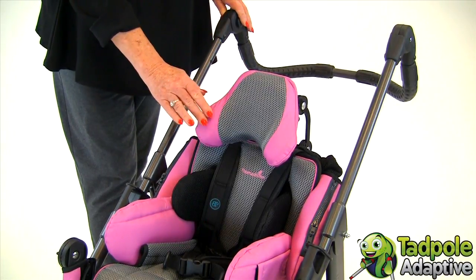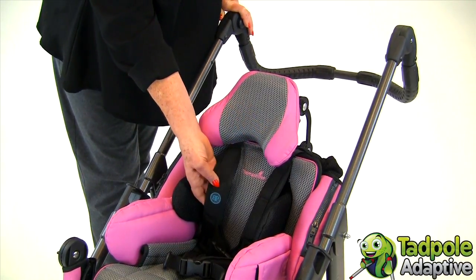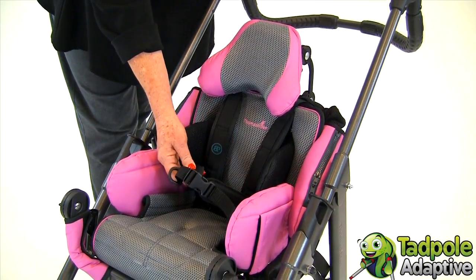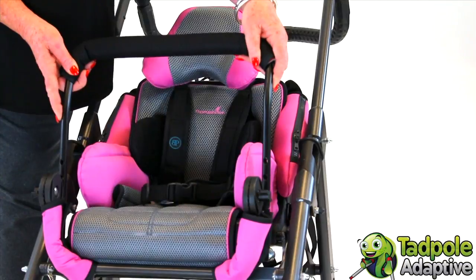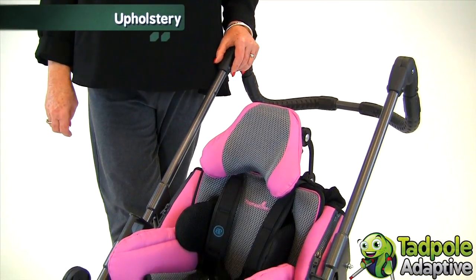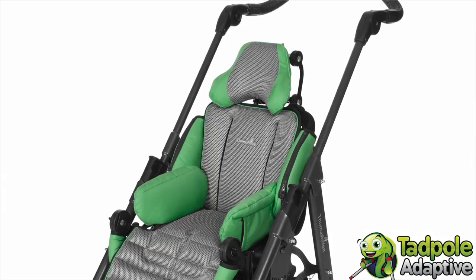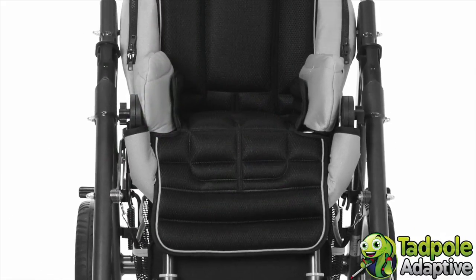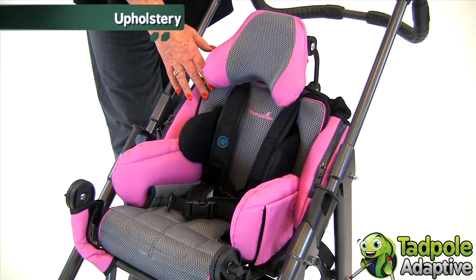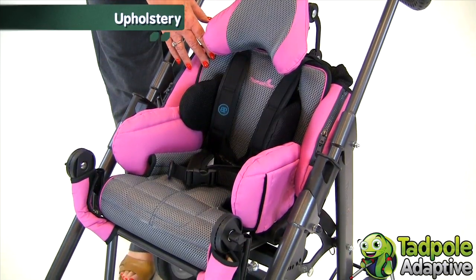T-Ride has a headrest that supports at the neck. We're also featuring today a padded H-belt, two-point padded hip belt, and a padded grab bar. The upholstery of T-Ride is breathable and washable. It comes in a light gray with contrasting pink or bright green. There's also contrasting black and gray available. The fabric is designed to keep your child cooler by moving the heat and moisture away from the child's back, keeping them cooler and more comfortable.